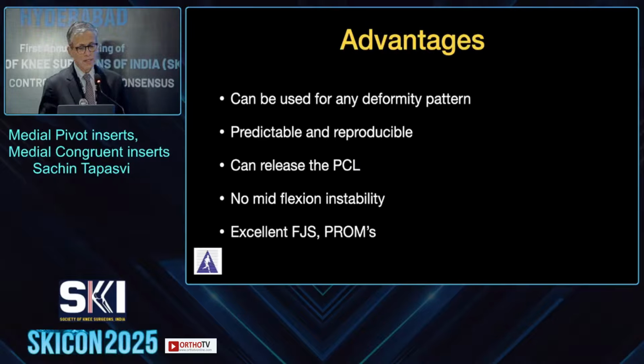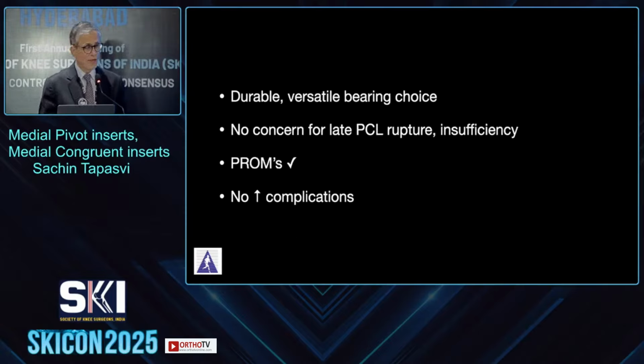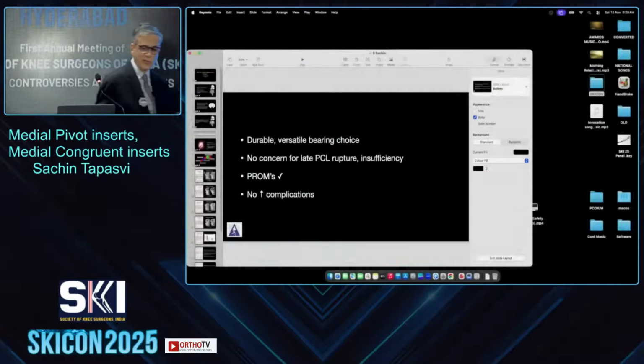So the advantages are it is predictable, it is reproducible, you can resect the PCL, there is no risk of mid-flexion instability, and this is definitely a durable, versatile bearing choice which has no increased risk of complications with good PROMs. Thank you.